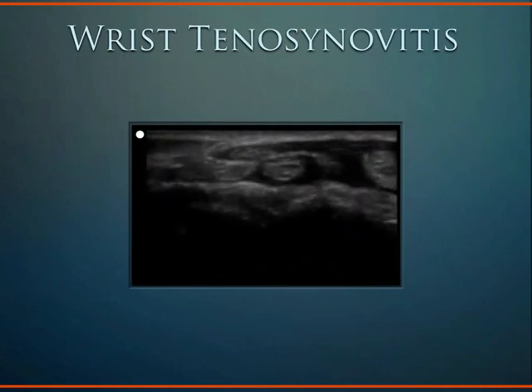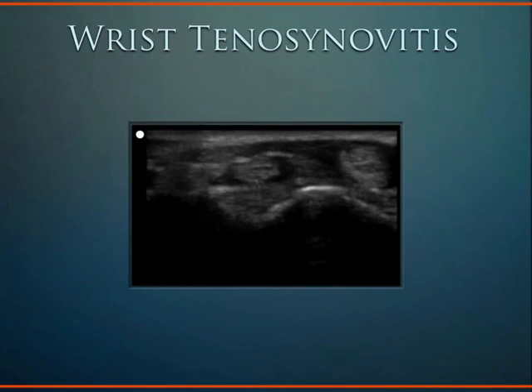We showed this image to our surgical colleagues, and they took the patient for a washout of that tendon sheath.